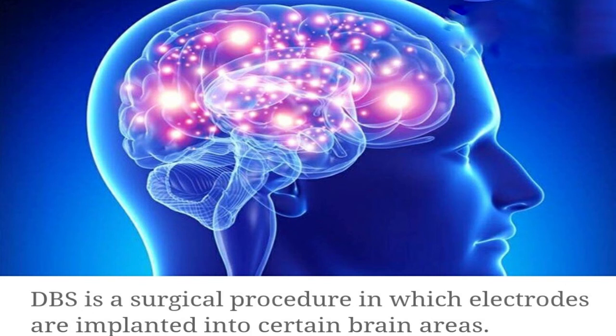Conditions that are traditionally treated using DBS include dystonia, epilepsy, essential tremor, obsessive compulsive disorder, and Parkinson's disease. In treating depression, however, previous clinical trials with DBS have shown limited success because most devices are only able to deliver constant electrical stimulation to one area of the brain, UCSF noted in a press release.